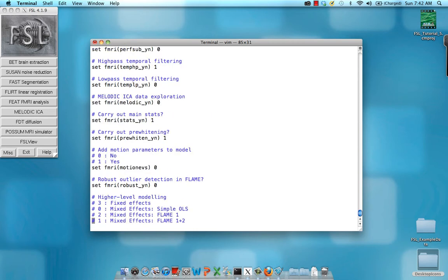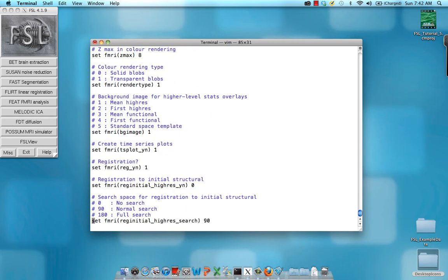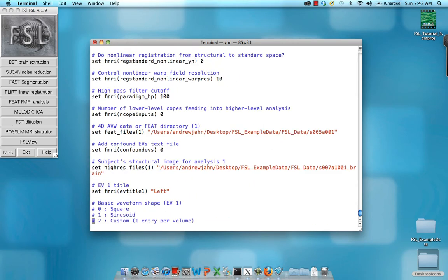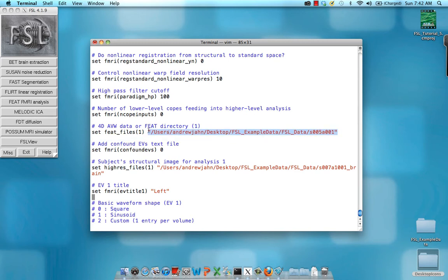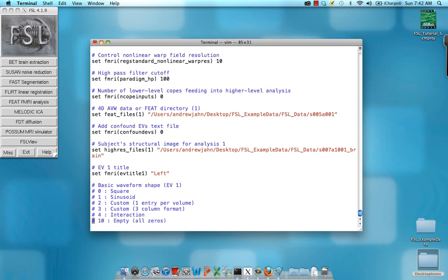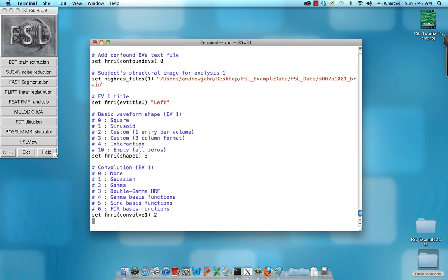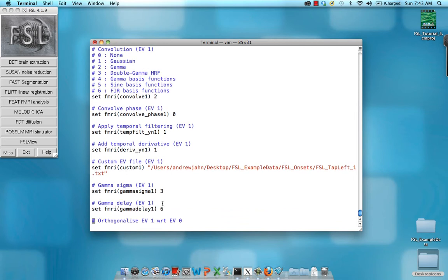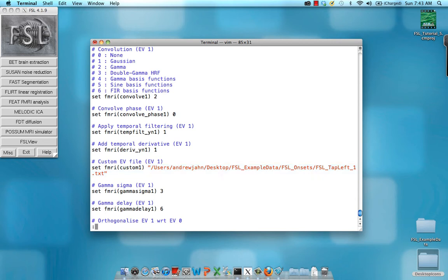I'm going to scroll down a little bit more here. Also notice this is the run of fMRI data that we used and input in there. We're going to change that later. And also, as we get down to the timing files, here you can see the timing files right here. That's something else that we're going to change.